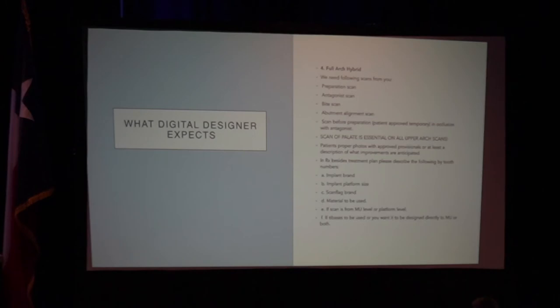Okay, we're gonna skip through all of this, but one of the big things is that we talk about scanning the palate. That's very, very crucial when you're doing a digital design process, because in a design process world, I can prep all the teeth and not even go through a rescue bite. This is gonna be a little bit confusing, but if you do full mouth, you're changing the vertical. If I prep all the teeth on the upper, now the bite's collapsed. That's probably the best use of digital dentistry that I do: I can prep all the teeth and I'm not stopping to make a rescue bite for the front to hold the vertical and then take the bite later with the bite registration. Why is that? Because in digital dentistry, we can stitch all that together. I can do a pre-op scan, erase the teeth, prep it, and now I have the prep and the bite stays there. But if you ever get lost, always scan the palate.